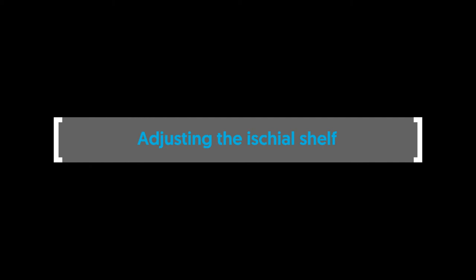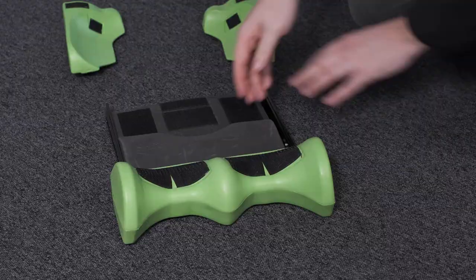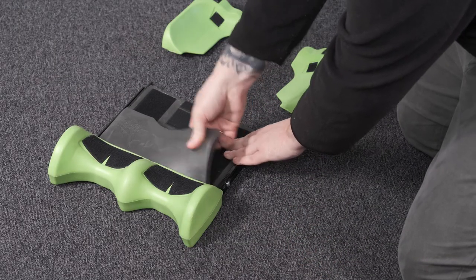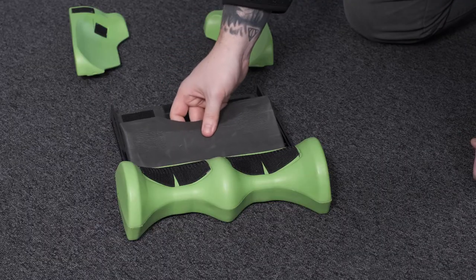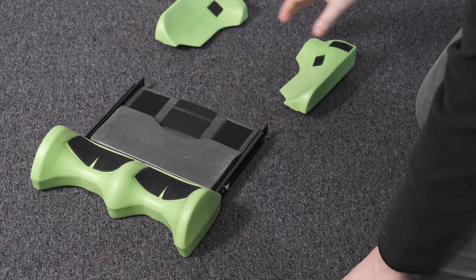Adjusting the ischial shelf. To adjust the ischial shelf, first remove the greater trochanter supports. Remove the ischial shelf from the velcro and place in the desired position. Replace the greater trochanter supports.